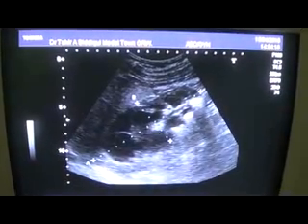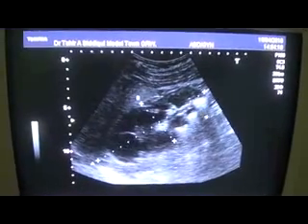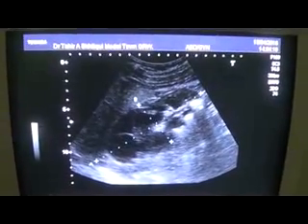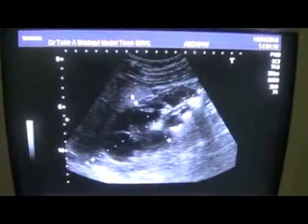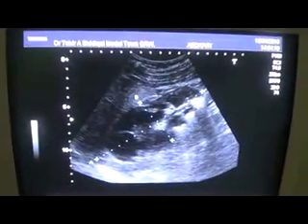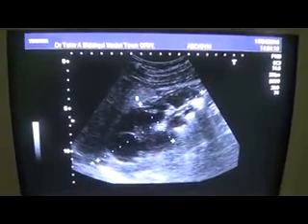Second important thing is we see multiple echogenic areas filling in within these cystic areas that you are seeing. Now these are all calculi. You see dirty shadow from here, not because this is a gas or a bowel, but rather the beam is not perpendicular while you take the image in this dimension, in this section, subcostally.